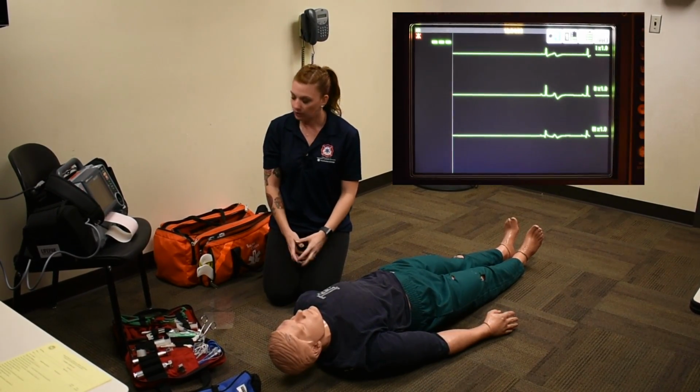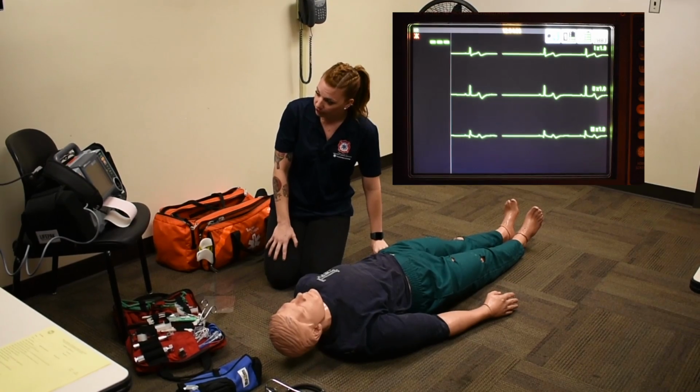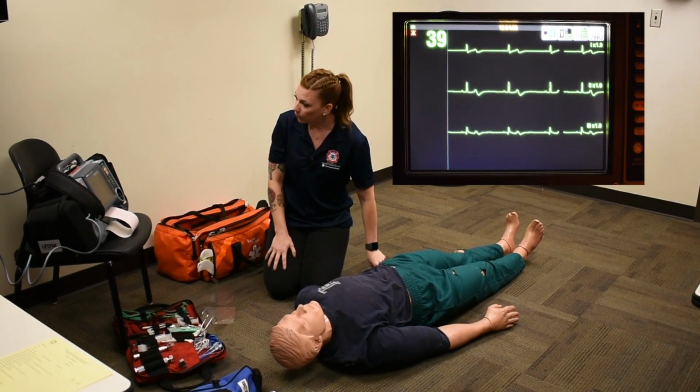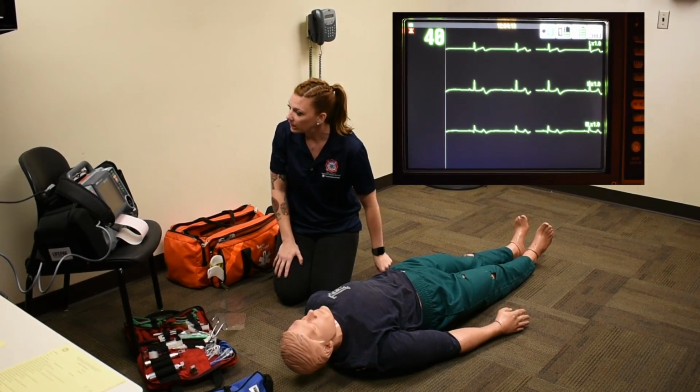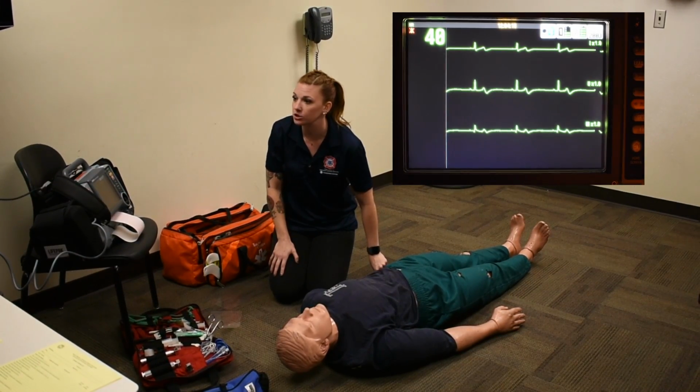And 2 minutes have passed. Okay, I see that I have a rhythm change. I'm going to check for a pulse again. You do have a pulse. I have a pulse. Feeling and looking at the monitor, I see that it does match the monitor. It looks like sinus bradycardia, so my patient is in ROSC.